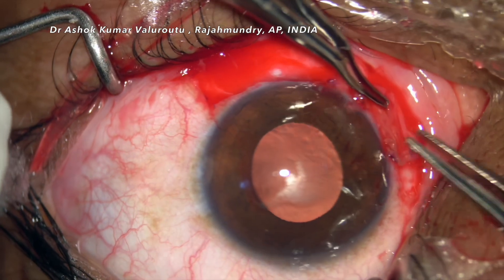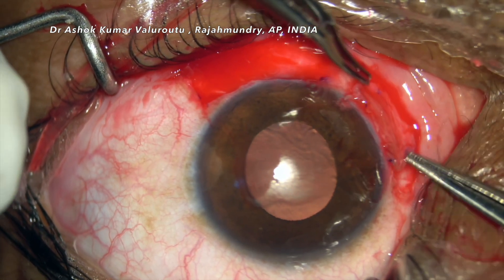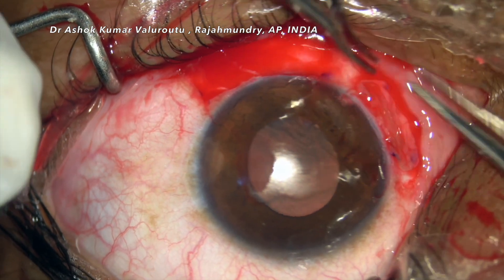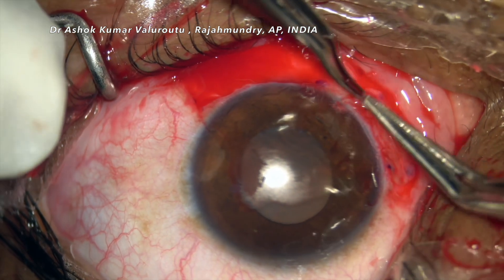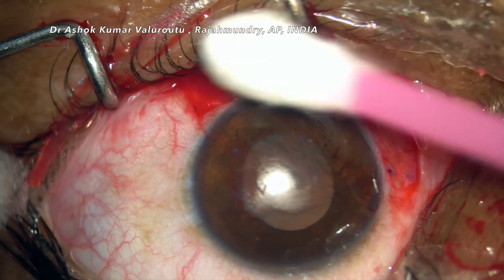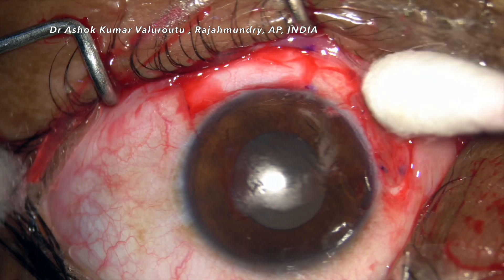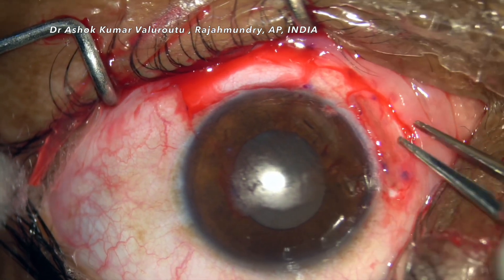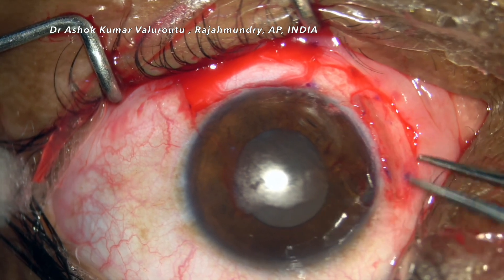Now we are placing the graft over the bare sclera. We iron it with instruments so that it is properly spread over and all the margins are overlapped. Once we confirm it is properly aligned, we check for any hemostasis issues near the host and graft area.